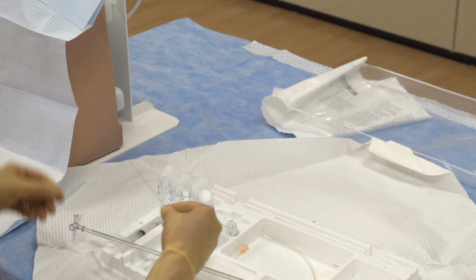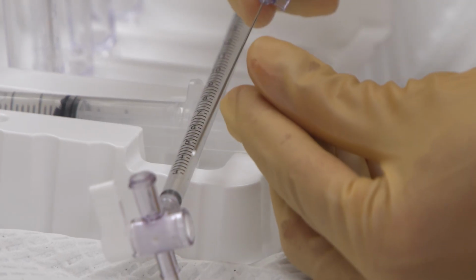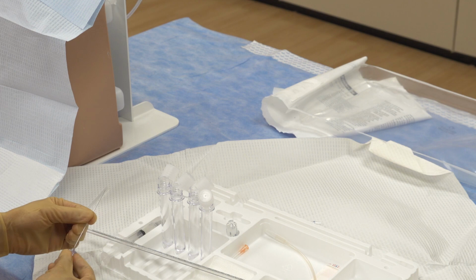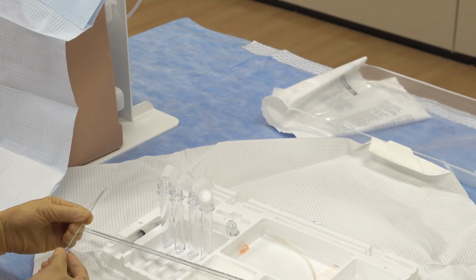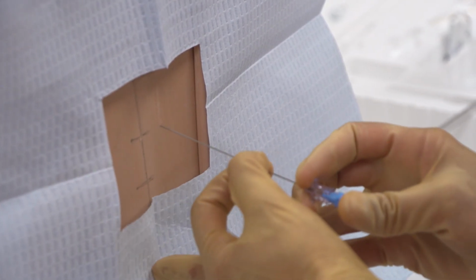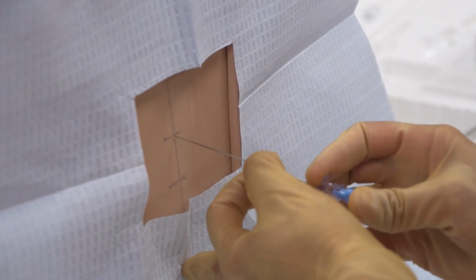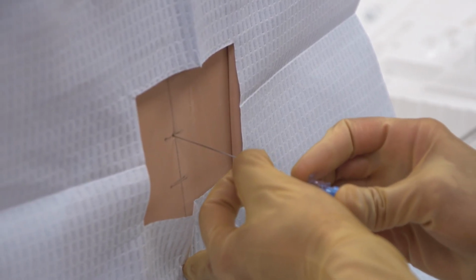In our case, we measured our spinal depth at around 4 centimeters. Pinch the spinal needle at that length with your non-dominant hand, as this will mark the point at which we will begin checking for CSF flow. Insert the spinal needle through your marked site with the bevel parallel to the cauda equina. The needle angle will be toward the umbilicus. Advance the needle slowly.